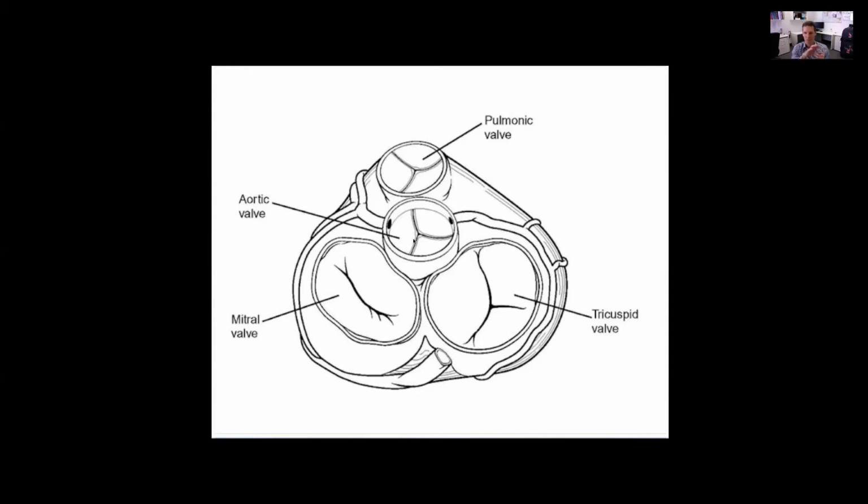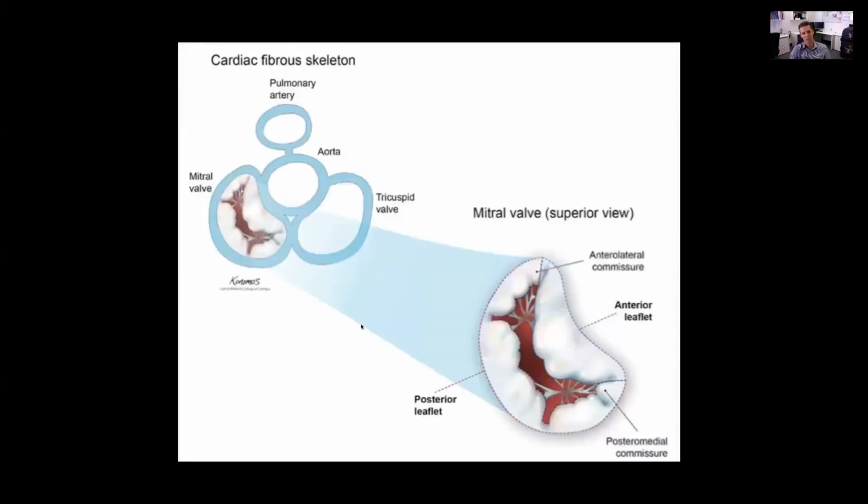You'll notice that the aortic valve is right next door to it, just at the front edge of that anterior leaflet. The aortic valve sits towards the front of the heart, and the mitral valve sits just behind it. What I think is really elegant, and where I find doing echo, particularly TOE, really amazing for looking at the mitral valve, is how closely all of these are linked together through the fibrous skeleton. The fibrous skeleton is really important, because if it gets dilated or abnormal, that's when we can start to see some of this functional MR, and we'll come on to that in a second.